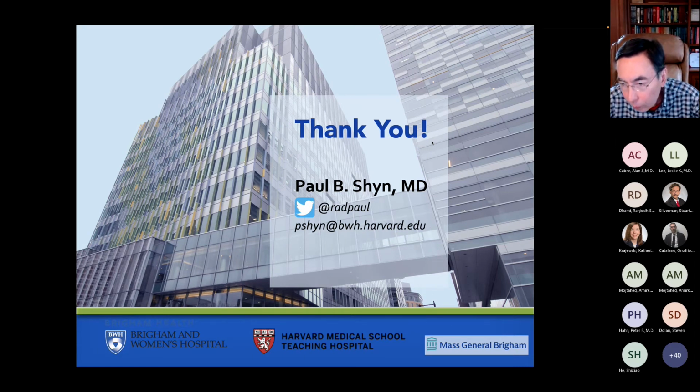I have a question for you, Dr. Shyn. Thanks very much for the talk. For the positive predictive value of LR-TIV, tumor in vein, I was a little surprised that it was only 54%. Is the other group including bland thrombus, or is it also partially the combined HCC-cholangiocarcinomas? Why is that not more predictive?